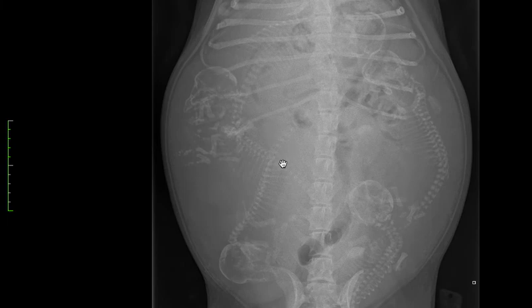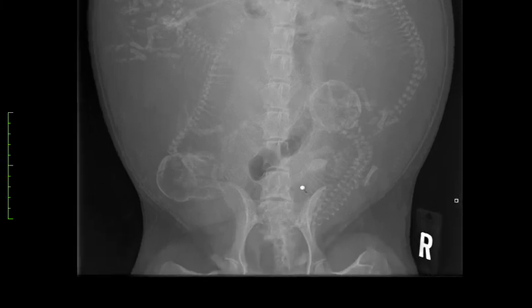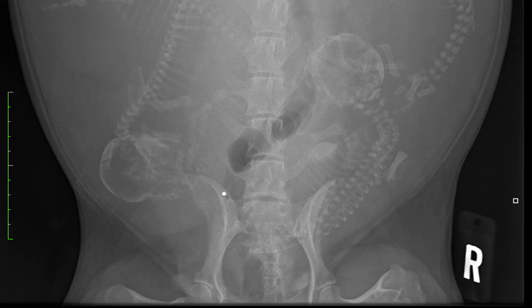When I go to the orthogonal view, as you know that I always like to look on both views, there's a lot of superimposition with the maternal pelvis, but you can see that not only is it tail first, but it's actually a little bit transverse in front of the pelvic canal instead of aiming caudally the way we would want it to.